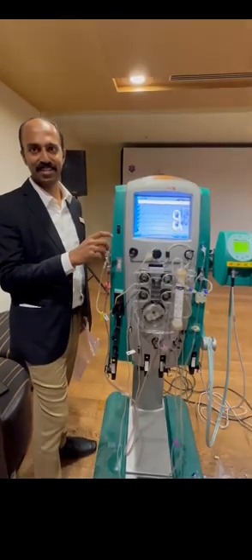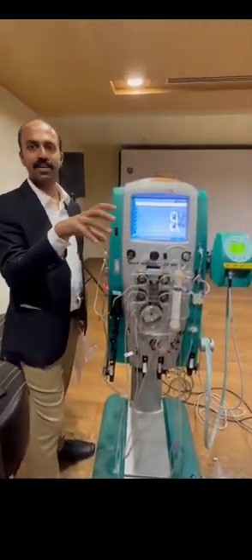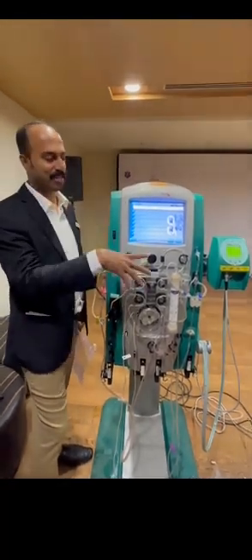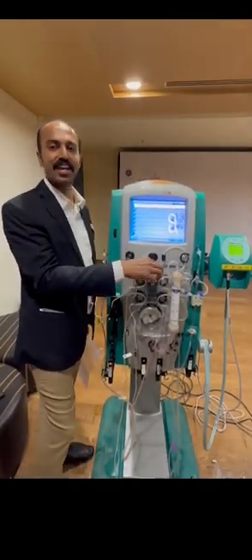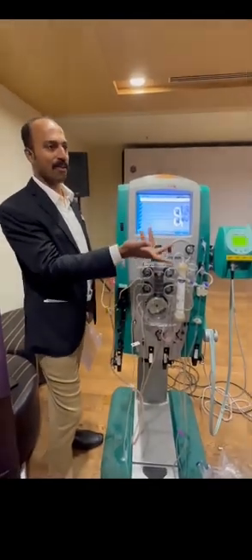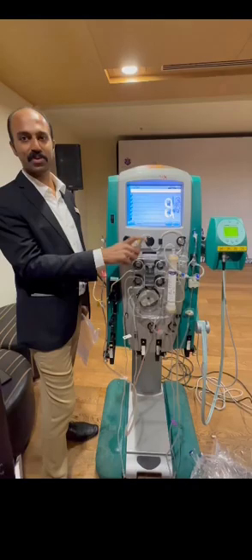Any possibility of reuse? No reuse, because in HD we are reusing maybe after 4 hours, maybe after 2 days. But this is continuously running, and maybe we are not giving any anticoagulation. And in ICU those patients' coagulation profile may be deranged. After 24 to 48 hours, we can't reuse this filter.